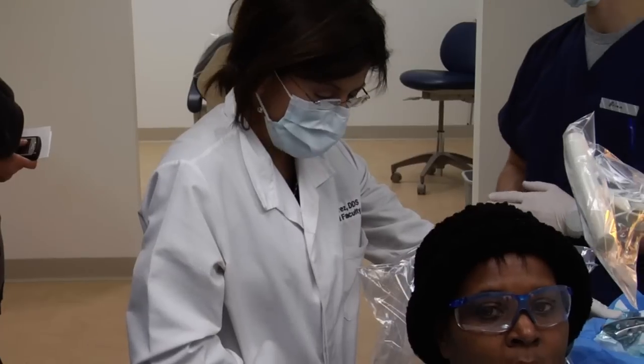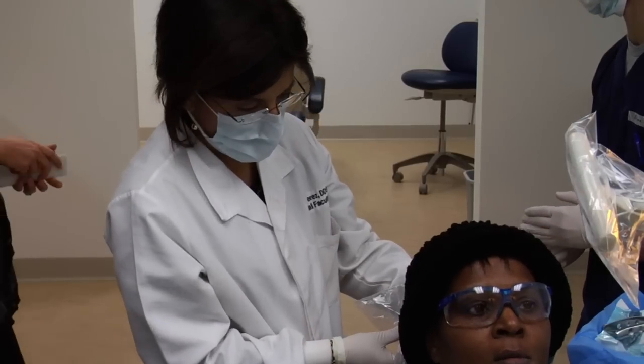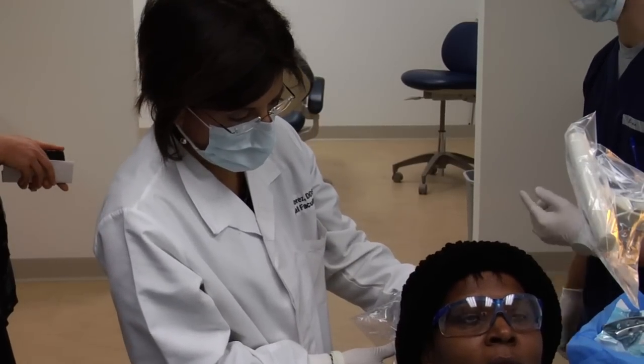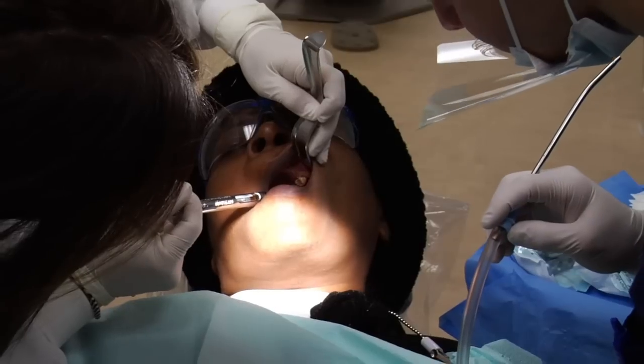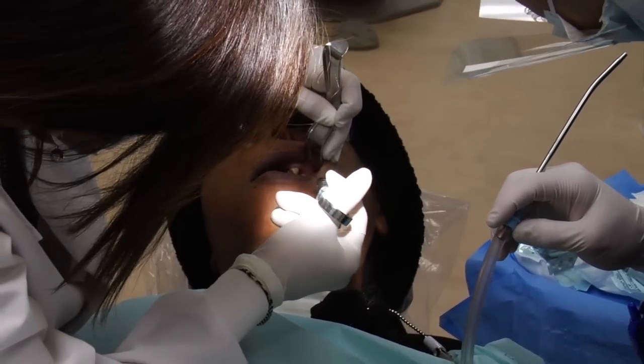Hi, I'm Dr. Helena Perez. I'm the chairman of the Department of Oral and Maxillofacial Surgery here at University of Detroit Mercy Dental School. The advantage of these instruments is because using a biomechanical advantage to take the teeth out rather than just your strength, it doesn't matter how strong you are. If the instrument is used properly, you get leverage, and difficult extractions can be done very efficiently.